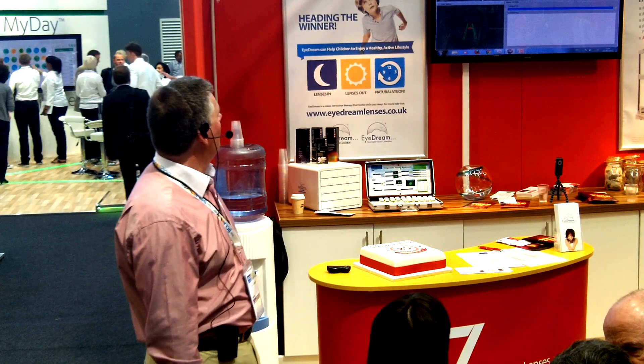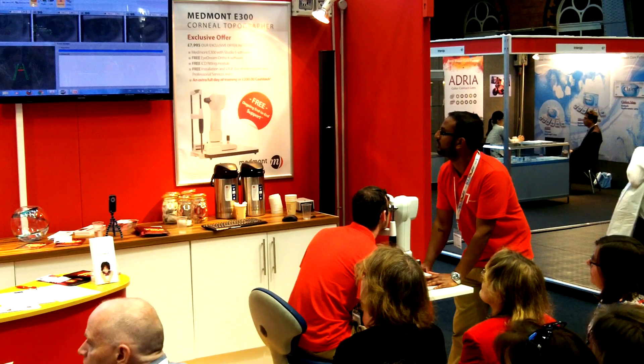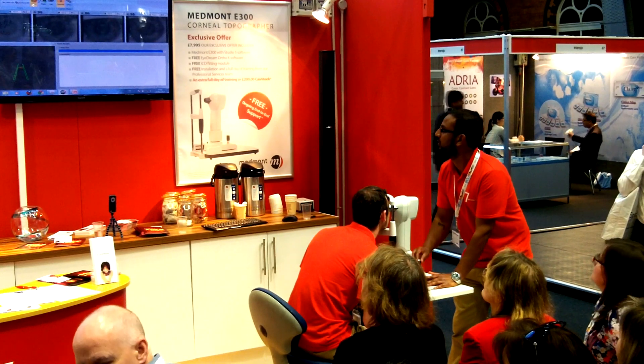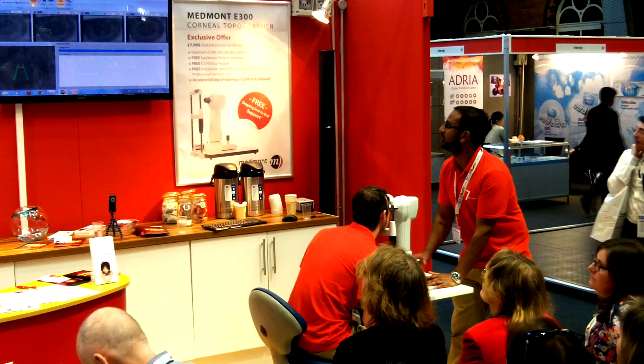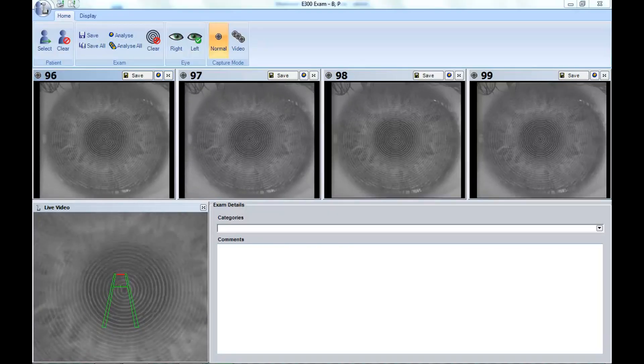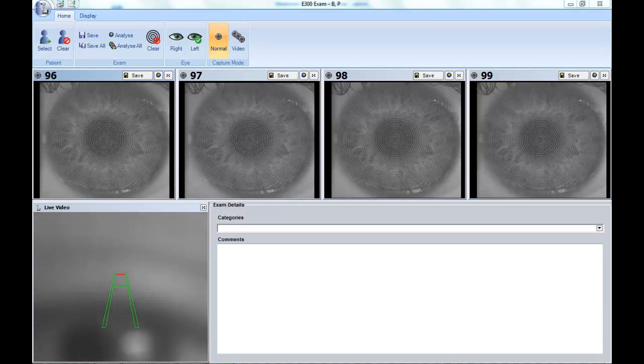If we look up in the top right-hand screen there, we've got a number 98 — that's given us a very, very good reading. This is a percentage score, so 98 is exceptionally good. We've got a 99 — rock and roll. 99 is about as good as it gets.